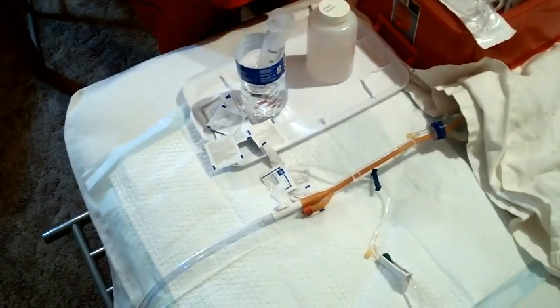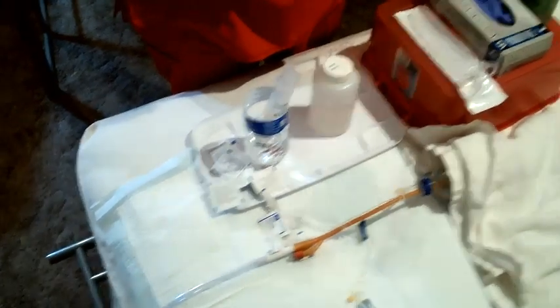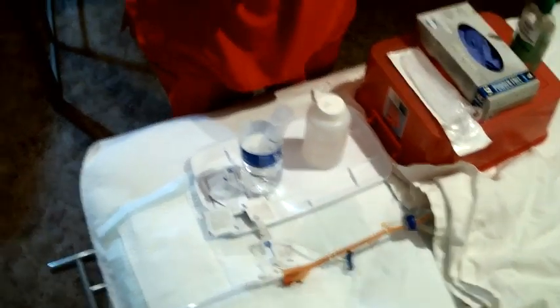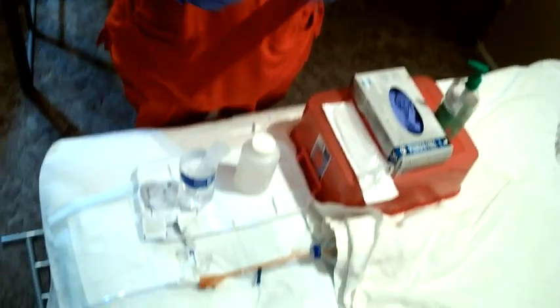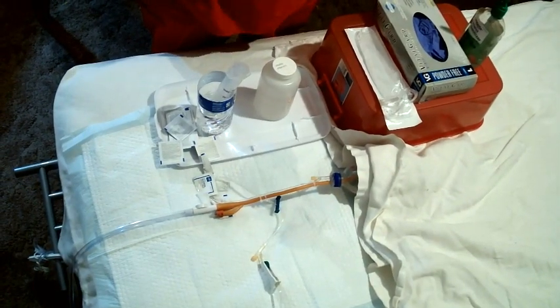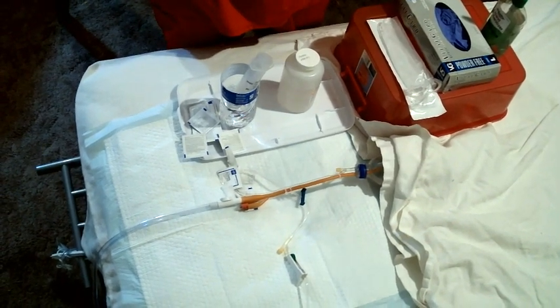As long as you see the urine improving, you can titrate the rate down. If it starts getting very bloody again, normally you have to titrate it back up. If you have questions, you should ask one of your senior nurses or your charge nurse — they should be able to help you. Thank you.